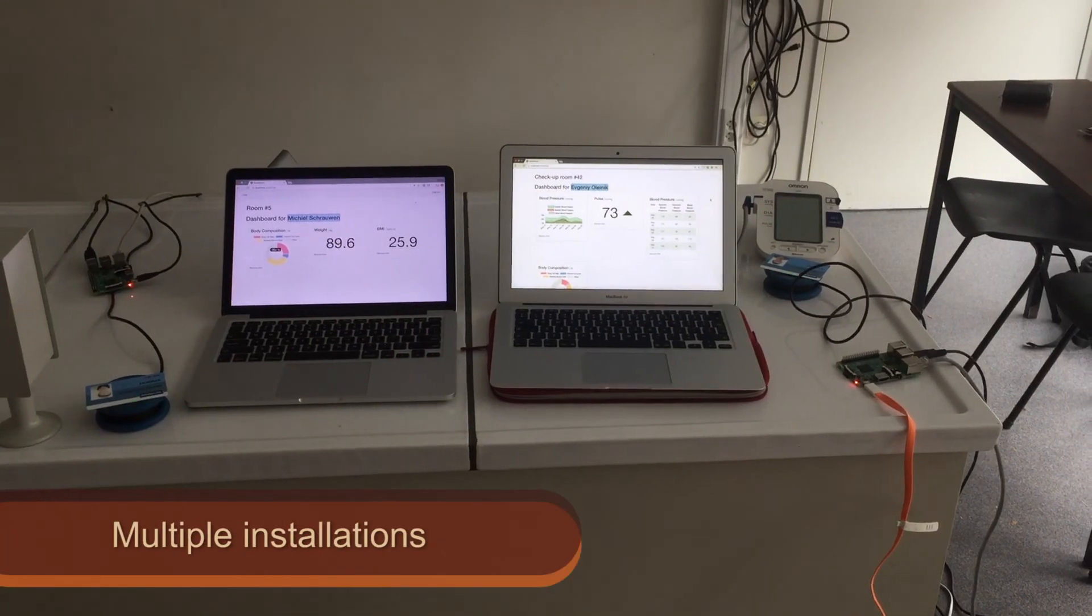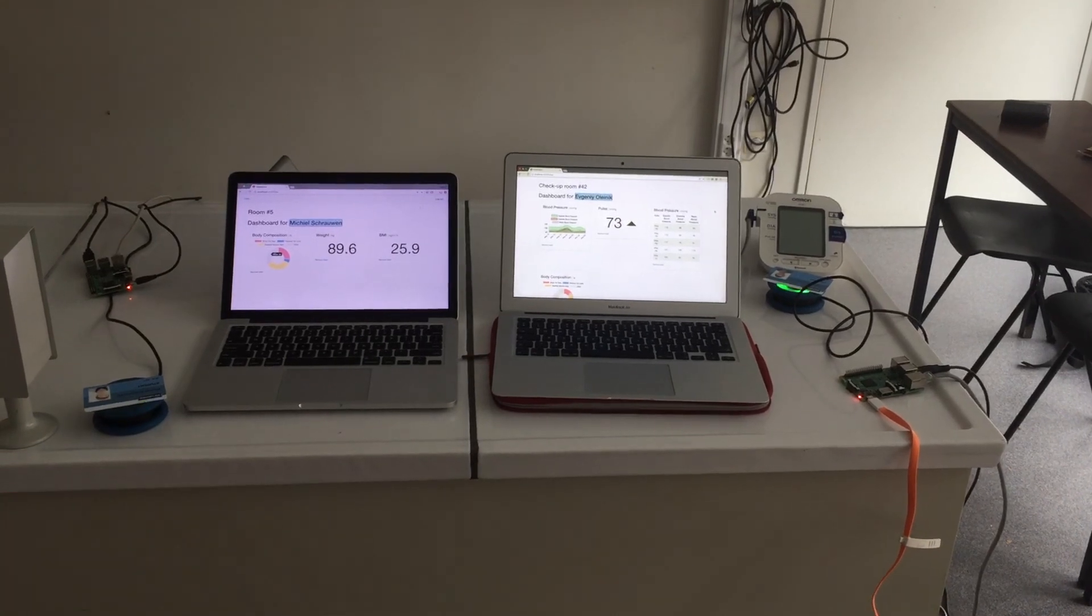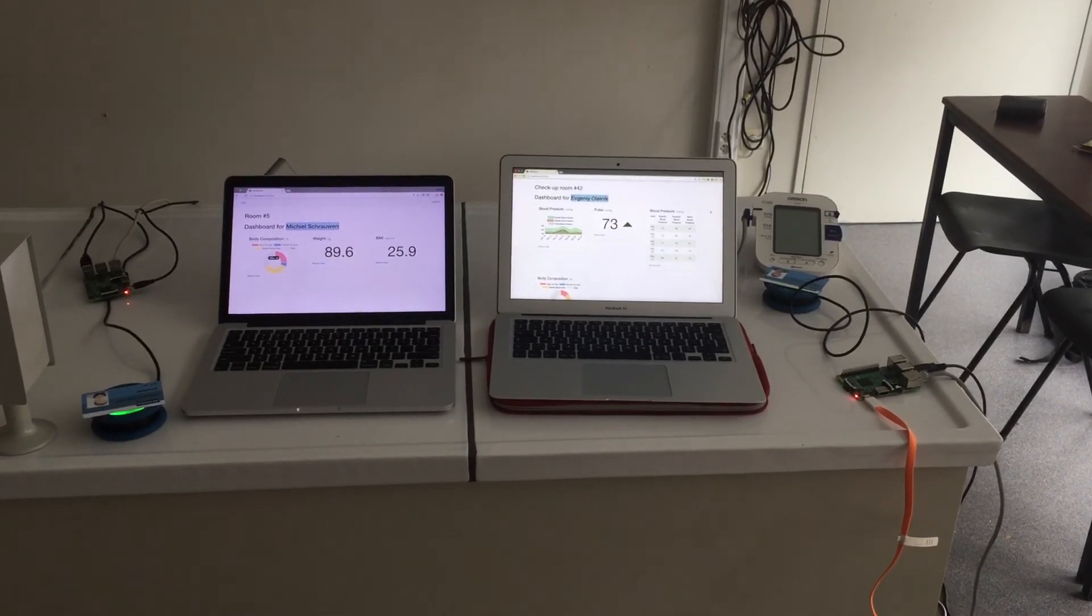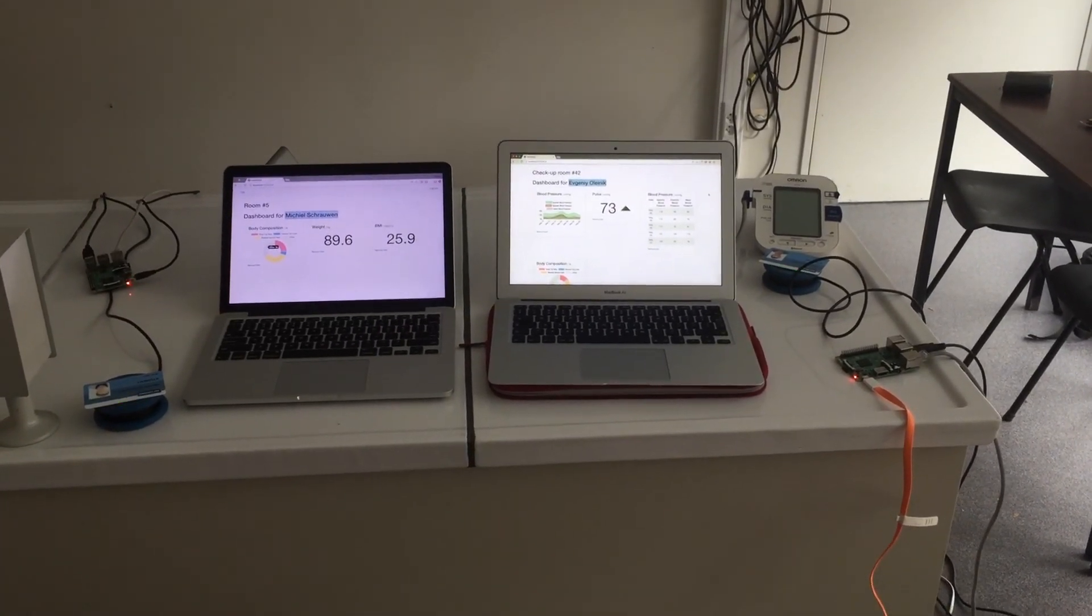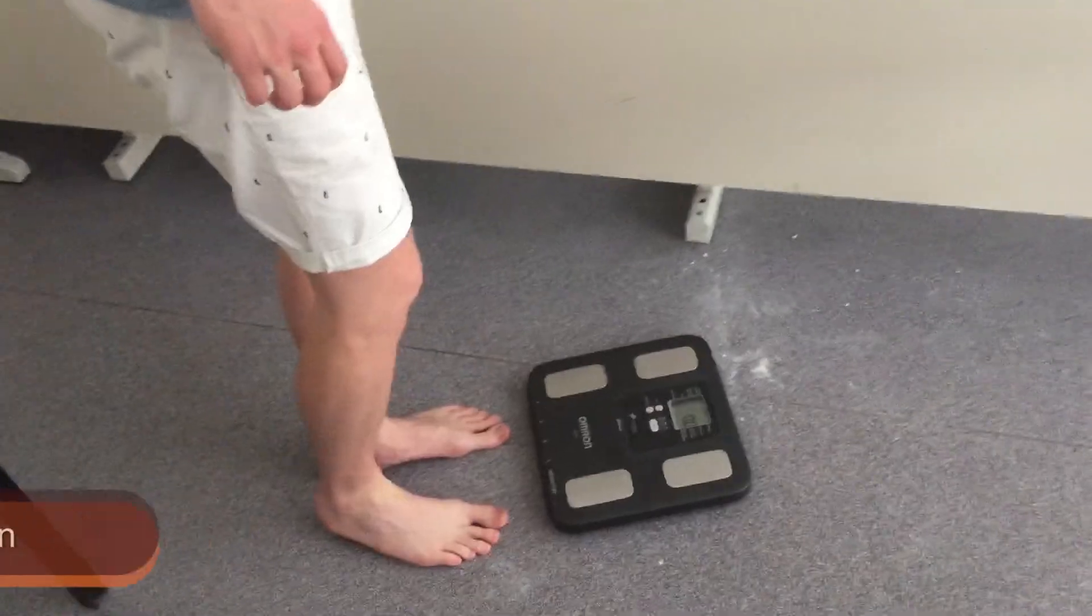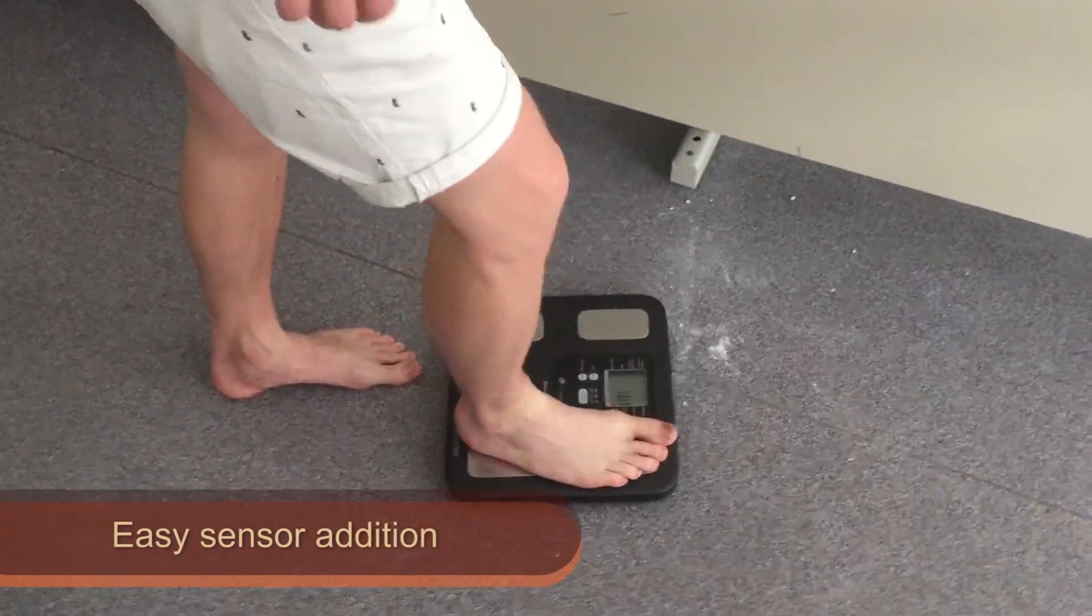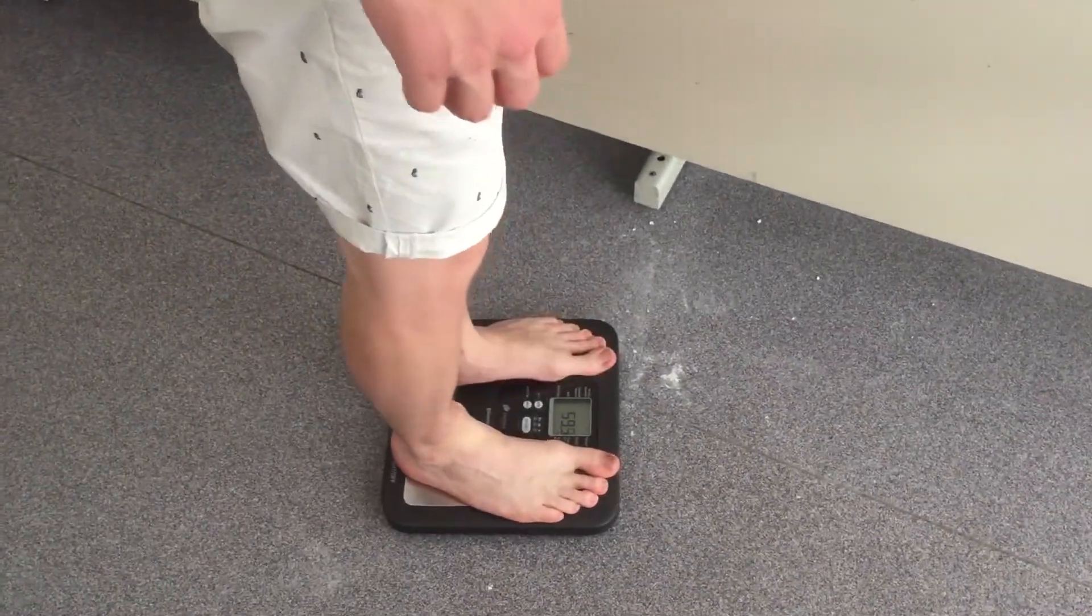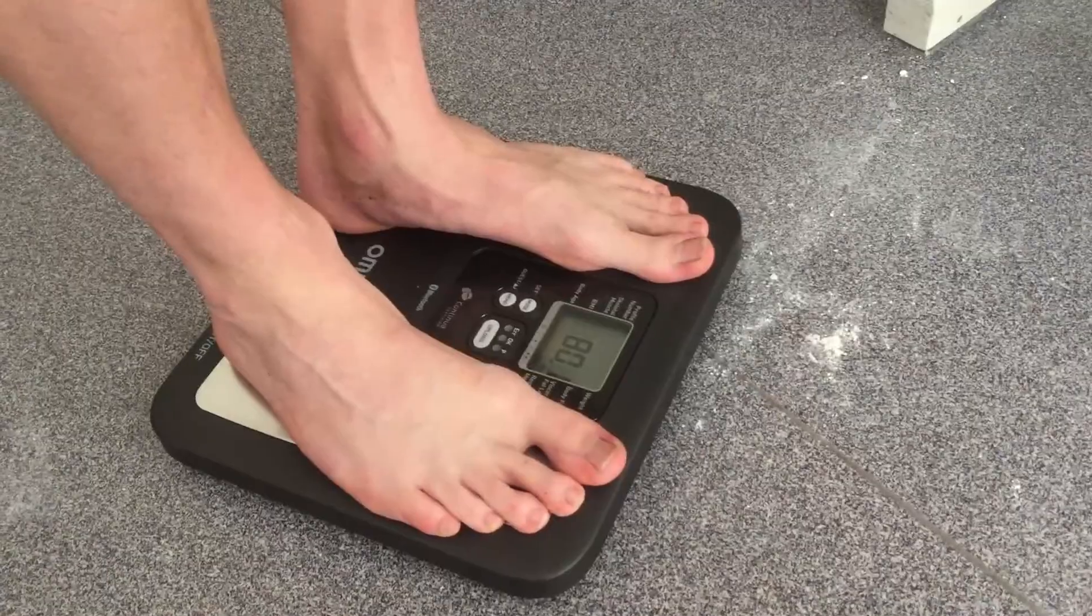HealthStations are ready to be installed in multiple hospitals without interfering with one another. New sensors can be easily integrated with HealthStation thanks to the modular plug-in system.